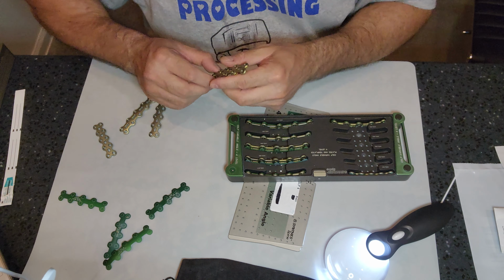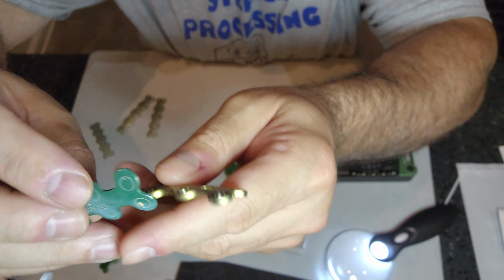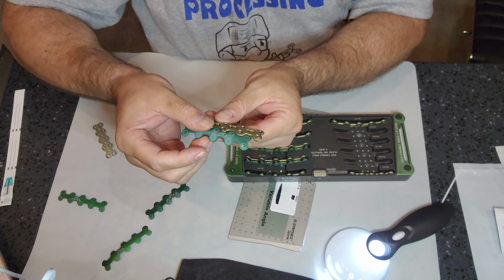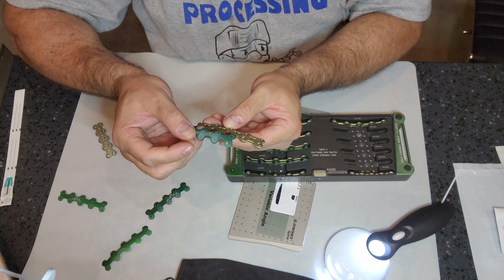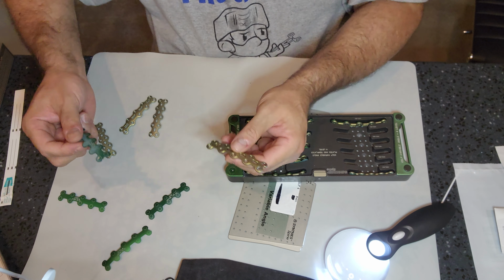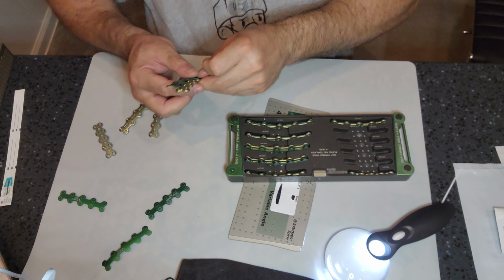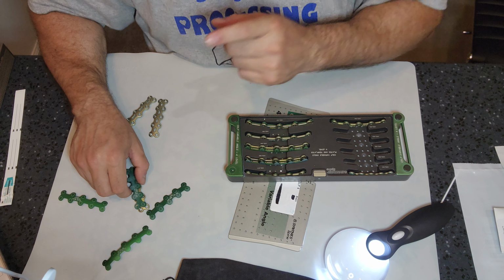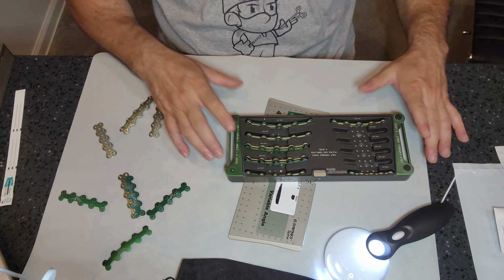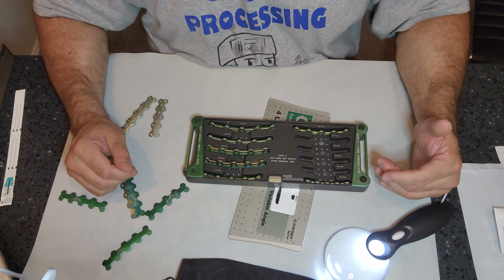So what do we do? I'm going to show you again. This trial is contaminated. This set right here, actually, this is the 182, 184. This is 184, and this is 182. So this doesn't even go together. So what happens to this trial and what happens to this implant? That's a discussion for another W.D.Y.D., CSP and Stir That Pot. But this is the cleaning, this is the prep and pack process.